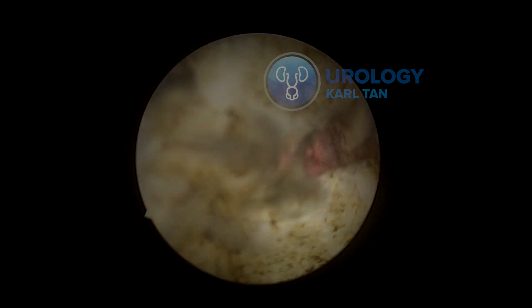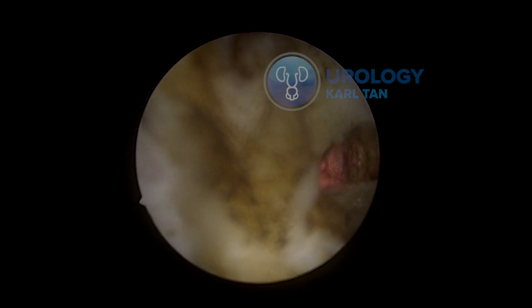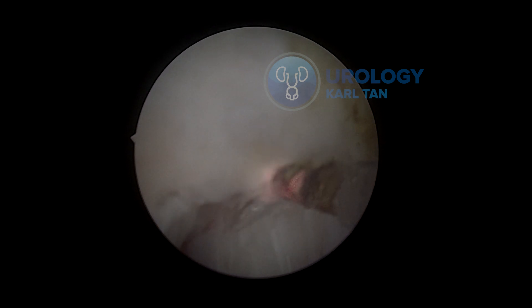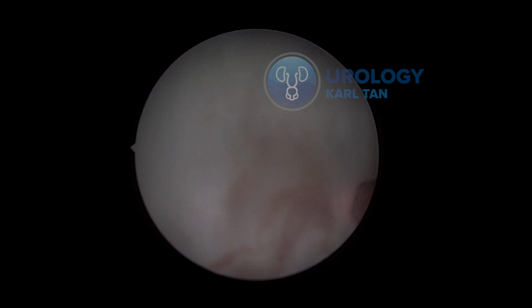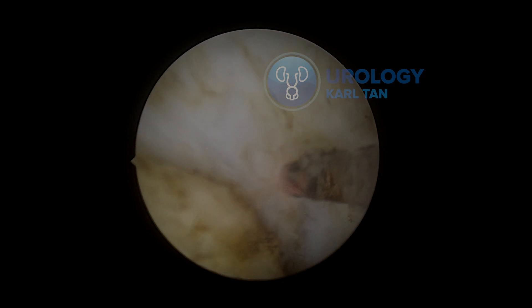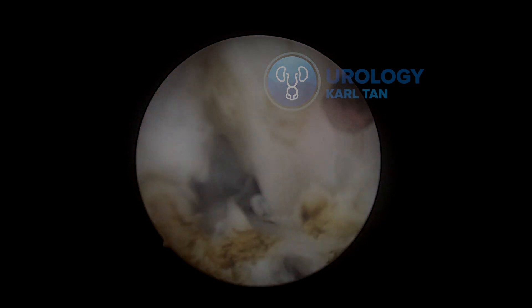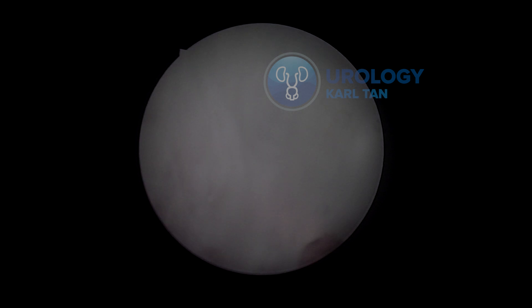When you're doing this, make sure your laser is not too deep and you should be able to see the tip of your laser fiber when doing the incision. I'm trying to do both blunt dissection and assisting with the laser so that the prostate will be released from the capsule.